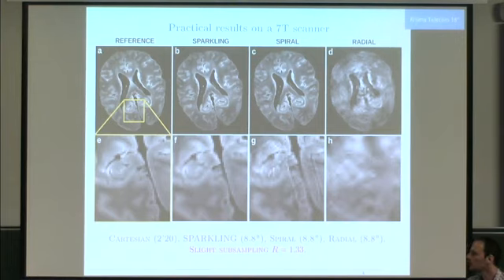I mean, the reference image looks like it has artifacts in it as well, in some sense, right? Yeah, so perhaps it has some aliasing already, and maybe here. But this is the thing that the manufacturer provides. In some sense, what we do is better because we use regularization here. Yes.